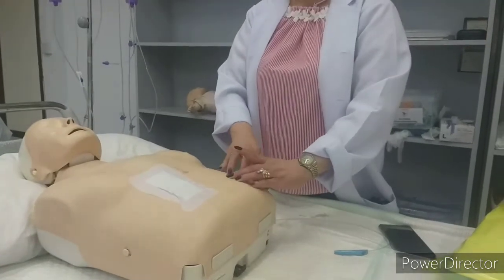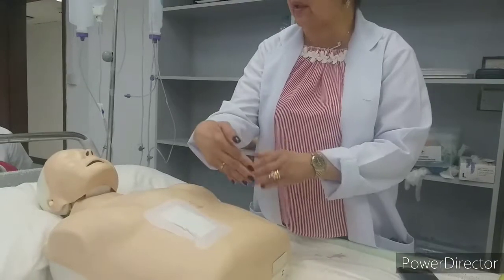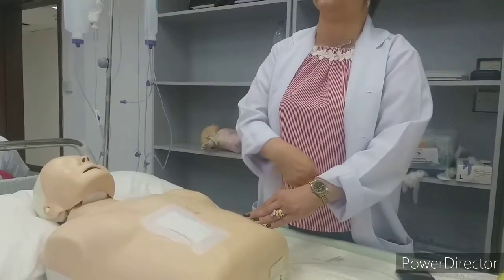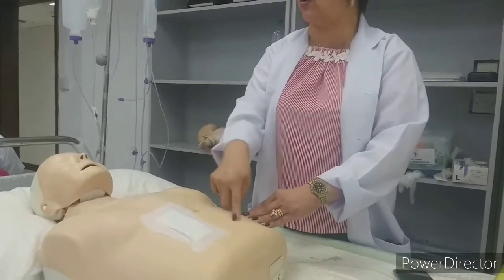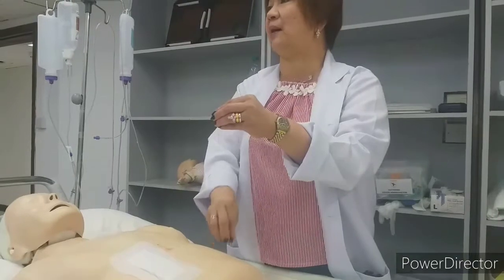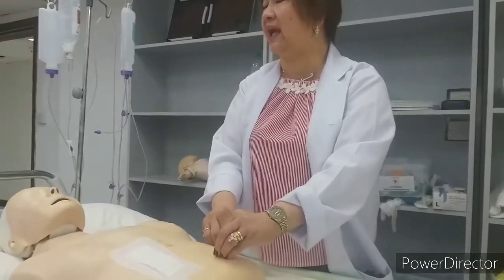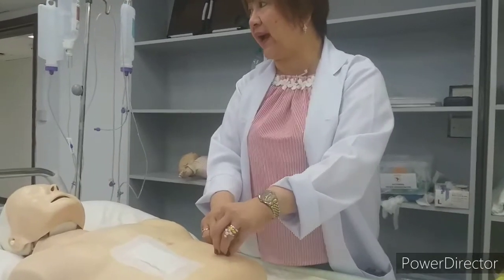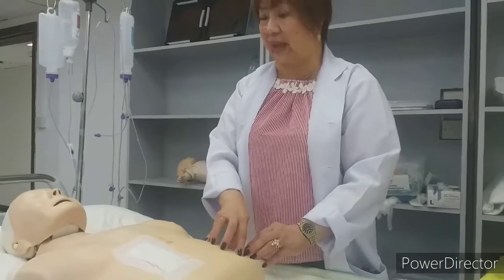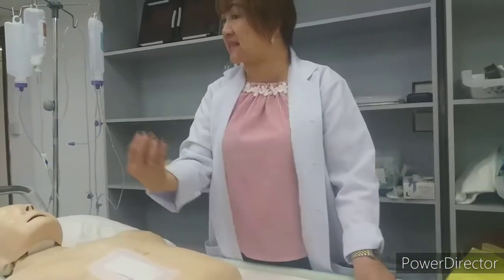So we are going to use this. When there is an obstruction inside your bowel, within your intestine, they are cut, closed, and you will be having poo-poo here until that one is healed. But it will be a longer time. So this colostomy is a piece of your intestine, which is out.